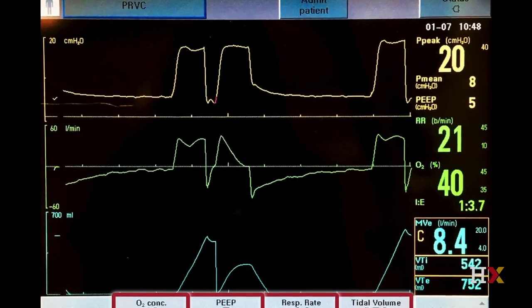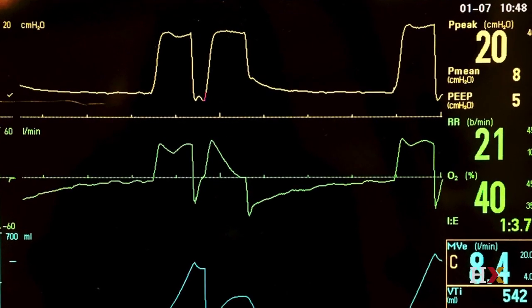Another thing that you may notice about this ventilator screen is that the patient is quite dysynchronous with the ventilator. You can see that there are jagged, irregular tracings here. When a patient has obstructive lung disease, just as with ARDS or pretty much any other disease requiring mechanical ventilation, we really don't want that patient to be dysynchronous. In the cases of obstructive lung disease, when a patient is dysynchronous with the ventilator, this can actually worsen air trapping as the patient is exhaling at irregular intervals and is not exhaling fully.